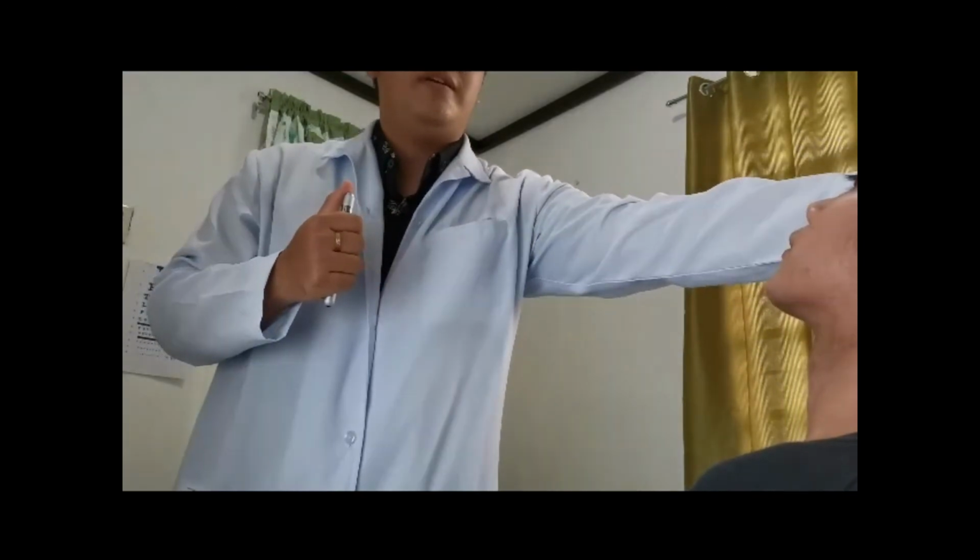Okay, so for our next step, we need to inspect the nasal cavities using a pen light or a nasal speculum. We need to tip the client's head backward. So please, may you tip your head back a bit, and we next push the nose tip upward, and direct the pen light into the client's nose.